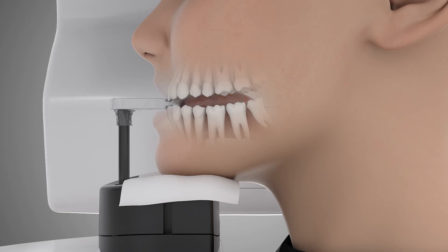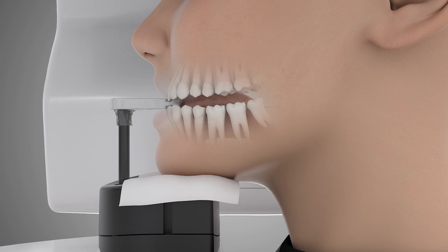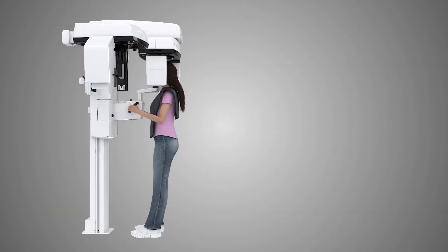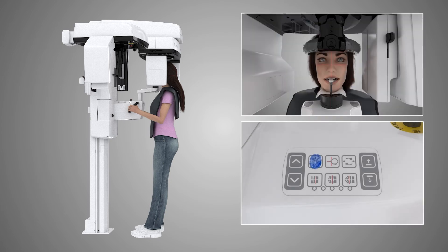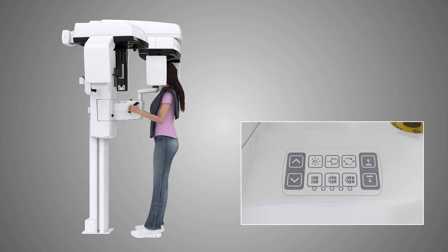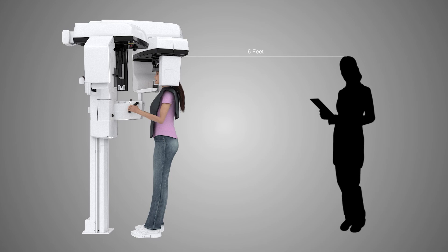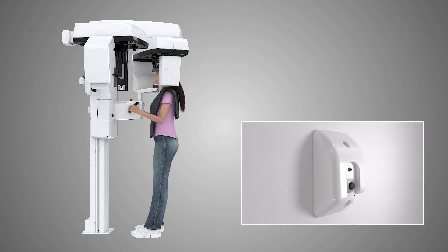Ask the patient to press their tongue to the roof of their mouth, swallow, and remain still for the duration of the exposure. Inform the patient that the unit will rotate around their head and will give off an audible signal that stops when the exposure is complete. Press the laser light button on the positioning panel and double check the patient's position. Make any required adjustments. Press the start button on the positioning panel. Move a safe distance away — at least six feet — or behind a suitable x-ray shield while maintaining line of sight to the patient during exposure.